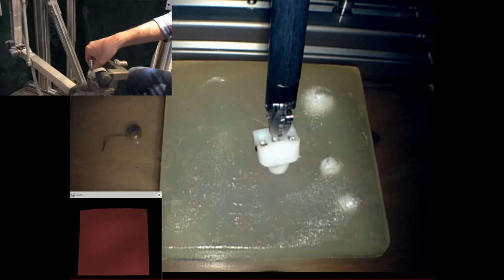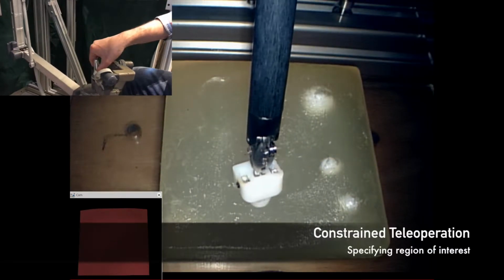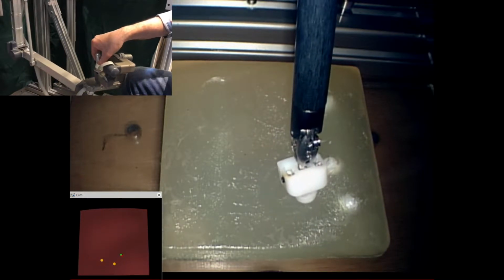Due to the complexity of the CSA framework, this demo focuses on a simple use case where a constrained telemanipulation framework allows the user to palpate a phantom organ with a model-mediated force feedback system. The user manipulates the master device shown in the upper left to control the slave robot.